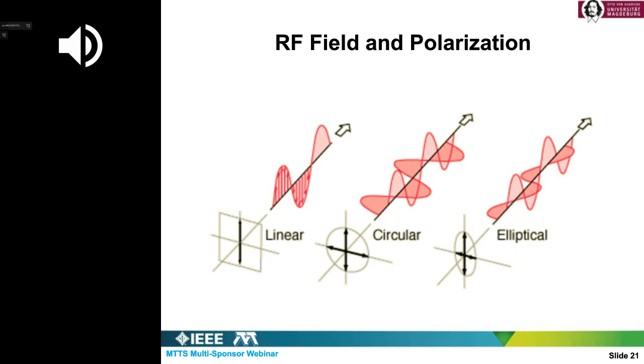Just to remind you what temporal polarization is: if you look at time-varying fields, you can distinguish between linear polarization, in which the electric or magnetic field has constant direction and only the magnitude changes, or circular polarization, in which you have two components of equal magnitude but with a phase shift of 90 degrees. So if you follow the electric field vector or the magnetic field vector, it rotates and traces a circle. The general form is the elliptical, which is a combination of linear and circular polarization. What we are interested in is the circular polarization.